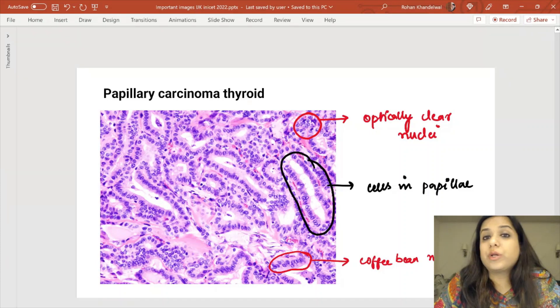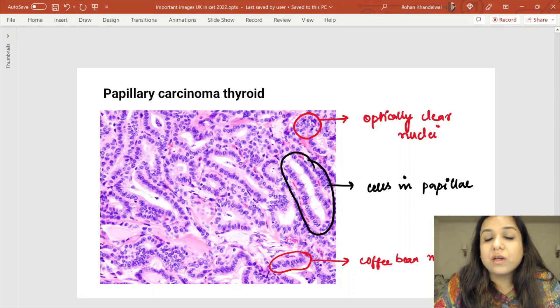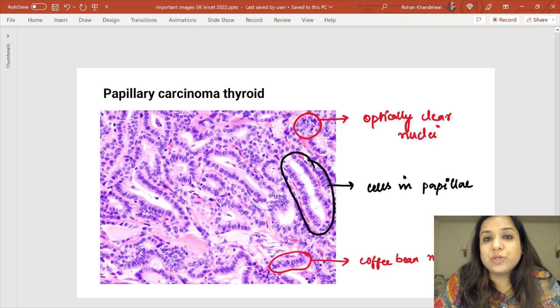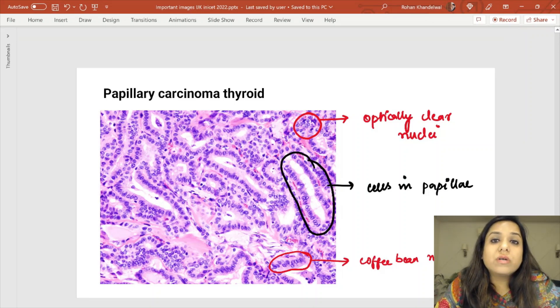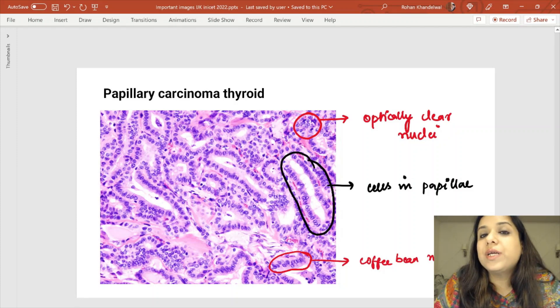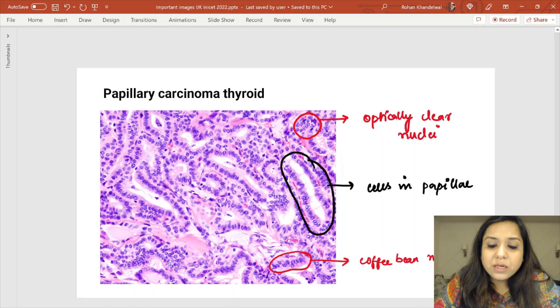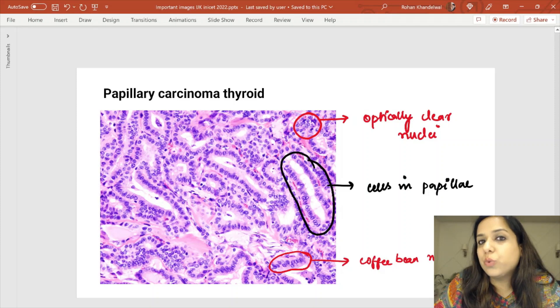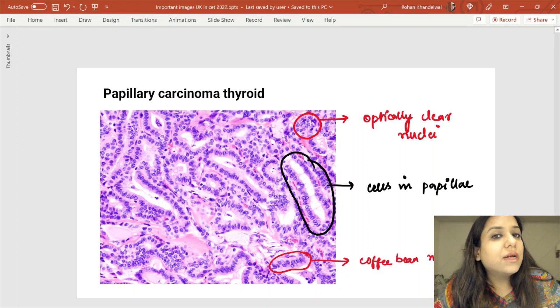Papillary carcinoma of thyroid — this image of orphan Annie nuclei is an examiner favorite, asked three times in the past four years in INICET. In papillary carcinoma of thyroid, you see papillae with optically clear nuclei compared to the eyes of little orphan Annie — called orphan Annie eye nuclei. The nuclei also show longitudinal grooves, called coffee bean nuclei, similar to those seen in Langerhans cell histiocytosis.